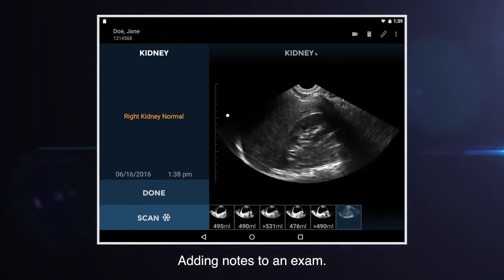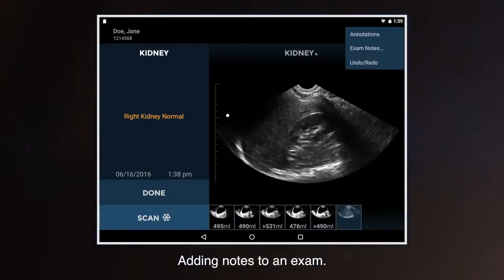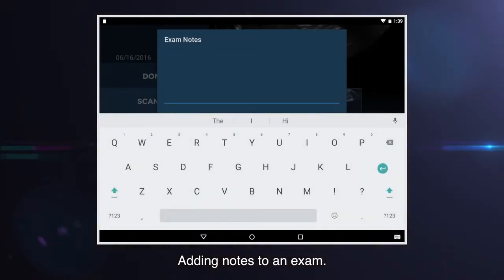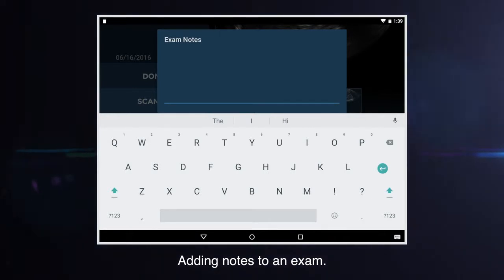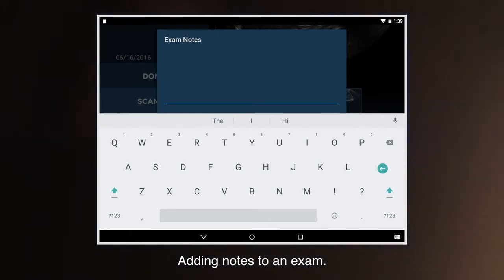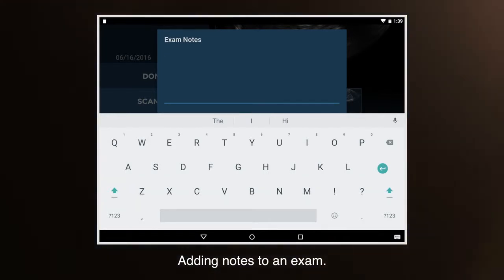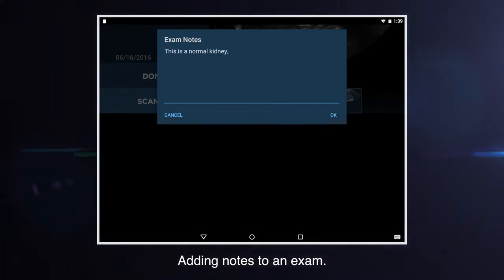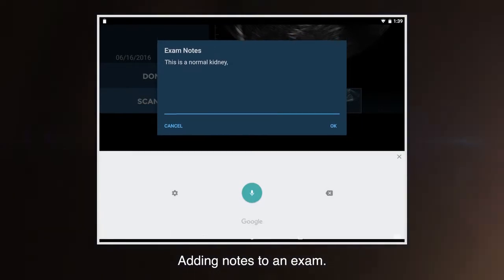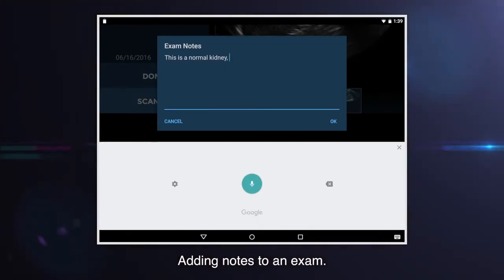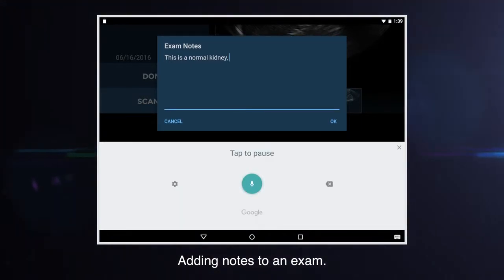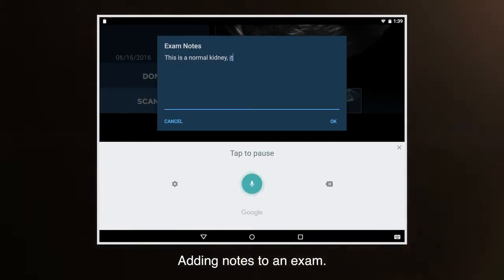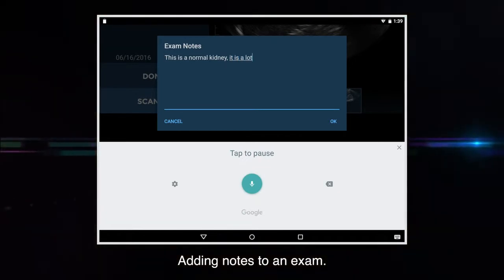An exam, which may consist of multiple images, can have notes attached. An on-screen keyboard is available for entering notes. Alternatively, tapping the microphone icon enables voice recognition to be used to enter patient notes.